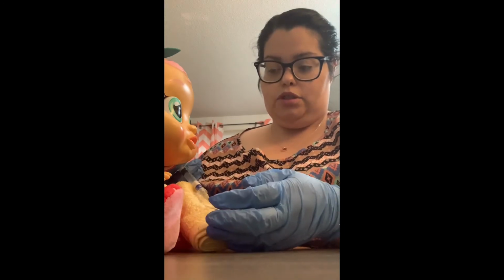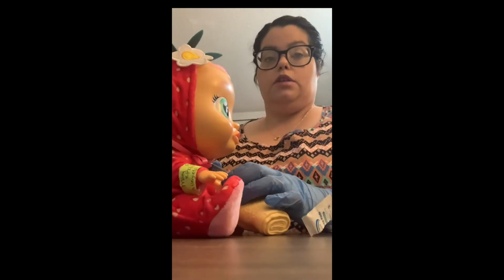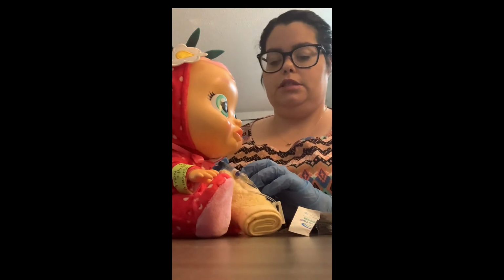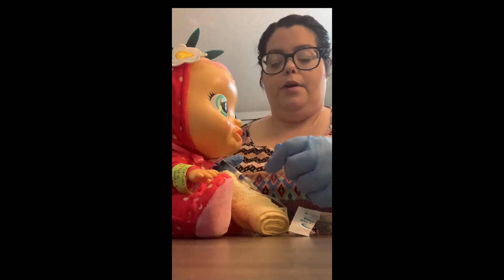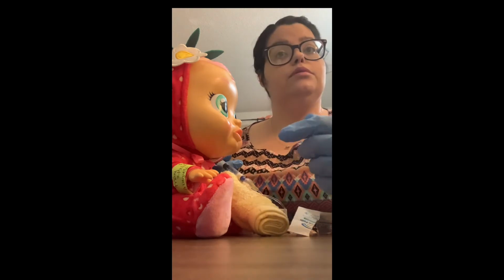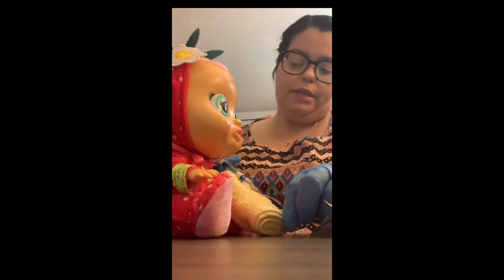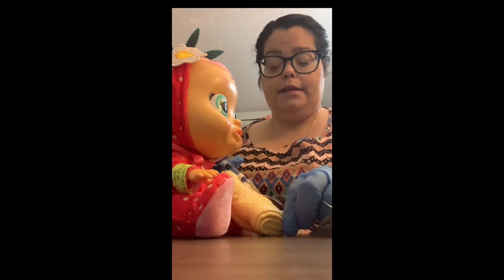doing IV push. We will give 1 ml in 30 seconds and then the next ml in the other 30 seconds. So at this time, we will be monitoring our patient, making sure she doesn't have any discomfort with this push. And we will be looking at the timer and pushing slowly. Mrs. Edwards, is this okay? The patient states that she's fine and we can proceed.